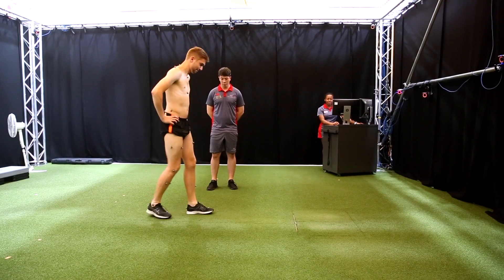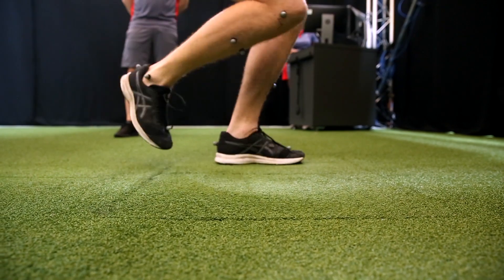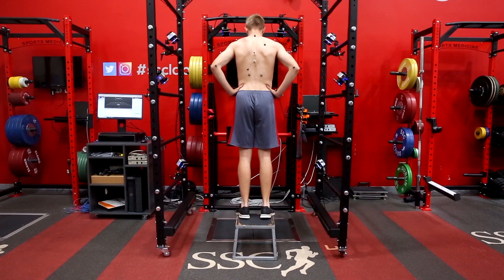All the data we collect goes to our Vicon system. It means that it's quantifiable, it's repeatable. We've got a setup that means we can have lots of different people involved in collecting the data and we can still have confidence in the results. The use of Vicon software has been brilliant at trying to objectify that and give some criteria to shape the rehabilitation.